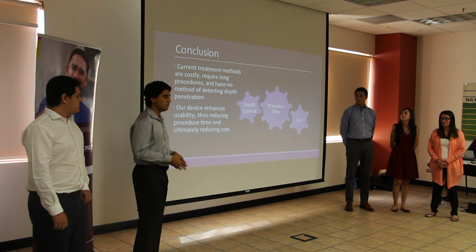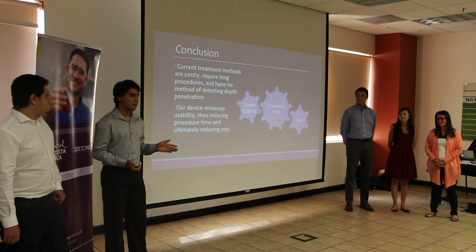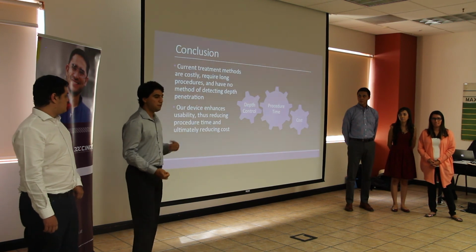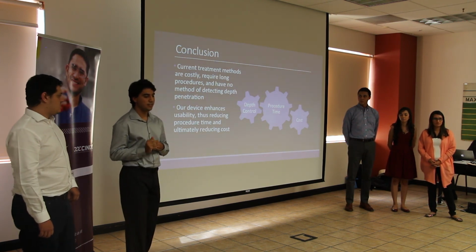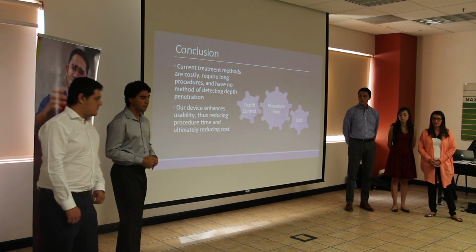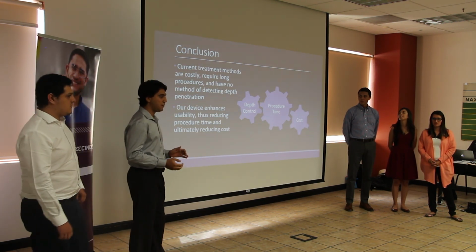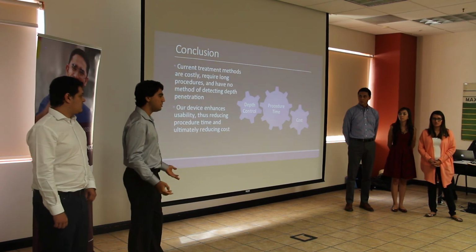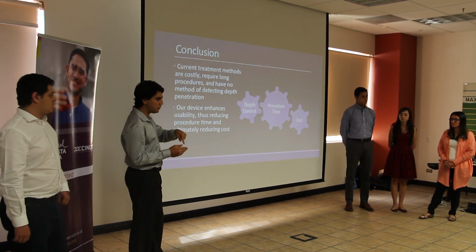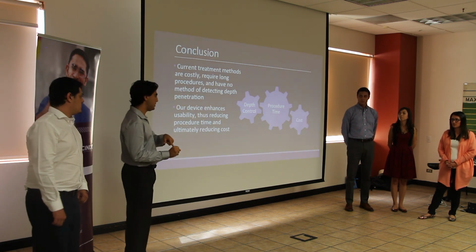What we would like to conclude, and for all of you to get, is that we actually solved the problem. As a recap, we were tasked with finding a device that would help enhance the experience of the patient who goes through a pericardiocentesis. One of the big things of the pericardiocentesis is that the doctor has to know a way to stop once he reaches the pericardium, before he reaches the heart.